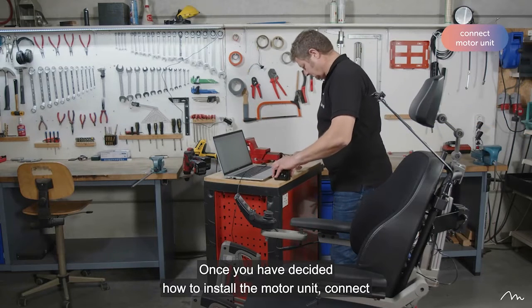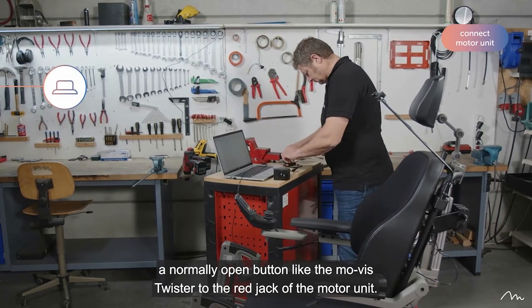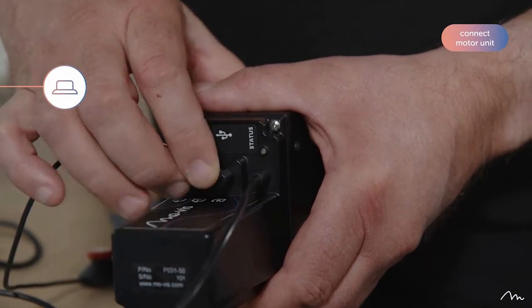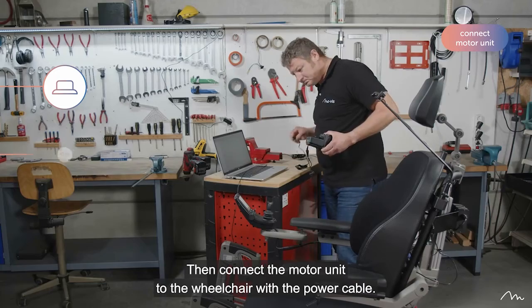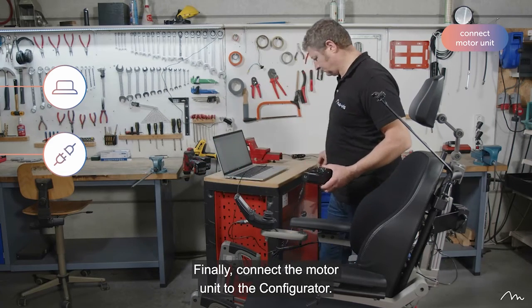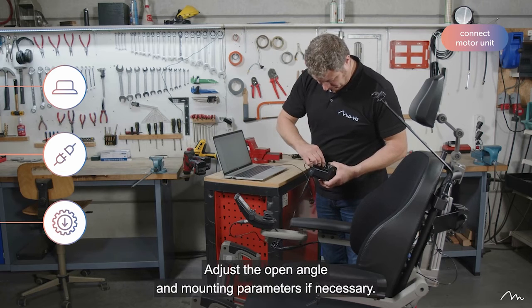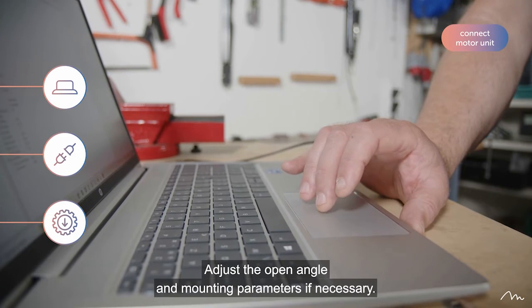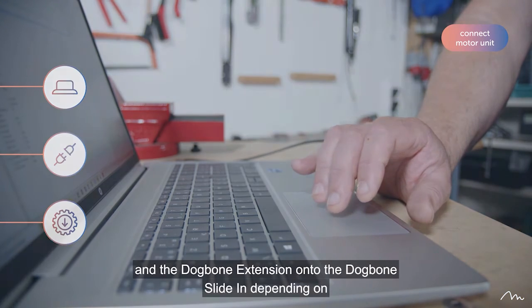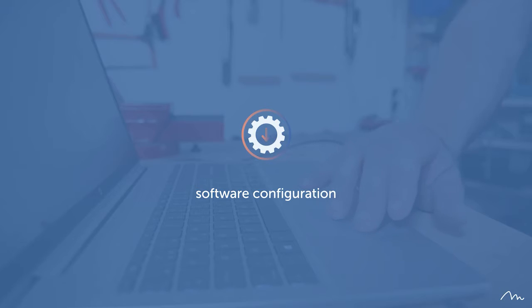Once you have decided how to install the motor unit, connect a normally open button like the mo-vis twister to the red jack of the motor unit. Then, connect the motor unit to the wheelchair with the power cable. Finally, connect the motor unit to the configurator. Adjust the open angle and mounting parameters if necessary. This will also be discussed later on in this video in the section about software configuration.